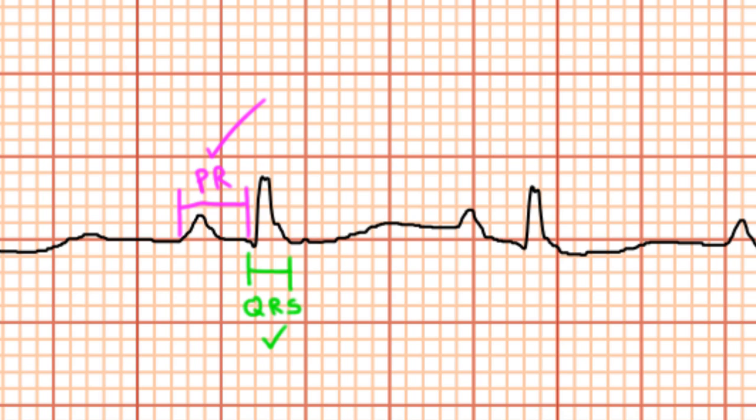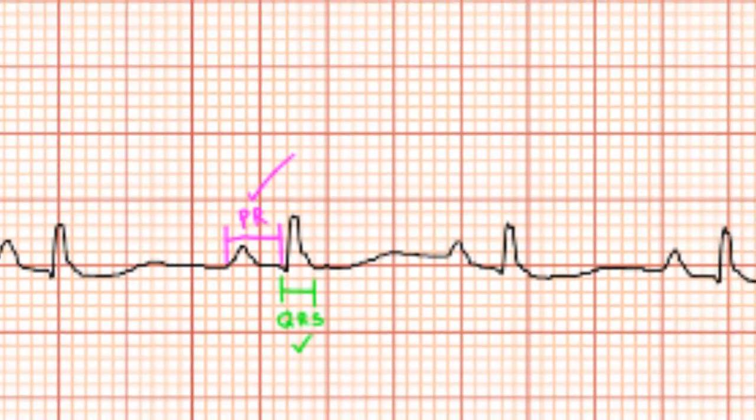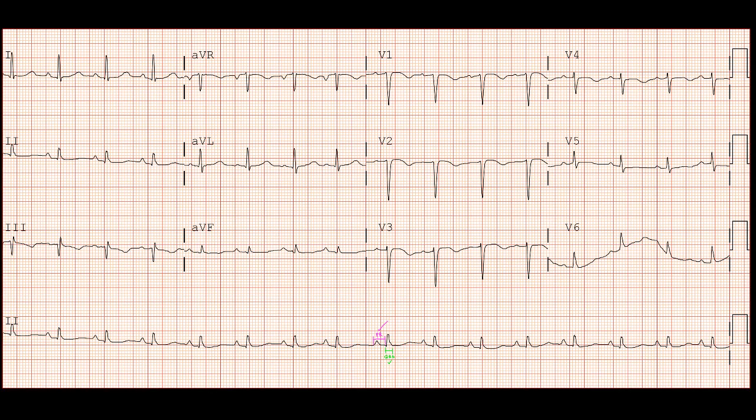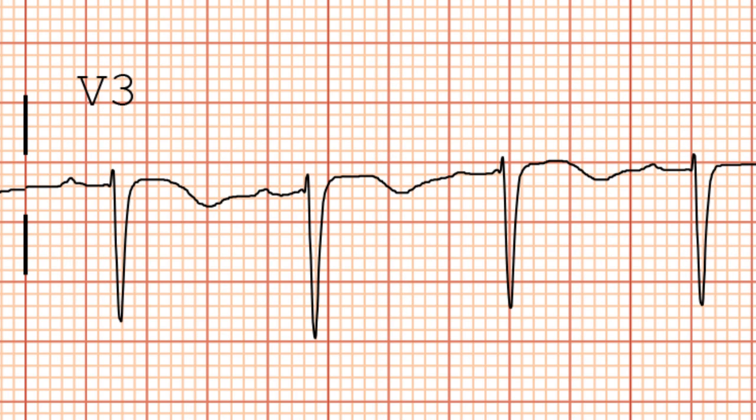For the QT interval, you'll notice that we can't see it that well in this lead. And so, let's take a look at another lead to get a better look. We like to pick the lead where it's most easy to find, and where it tends to be the longest. Looking at these leads, I'd say it looks longest in the precordial leads. So, let's take a closer look at lead V3. Here you can see after the QRS complex, you have the ST segment, followed by an inverted T wave.